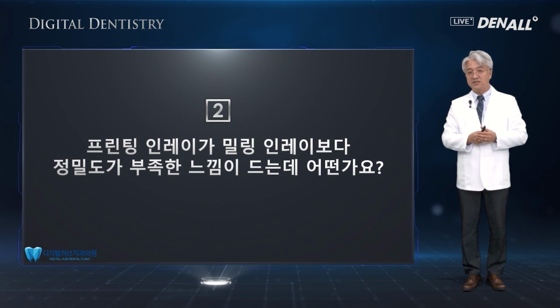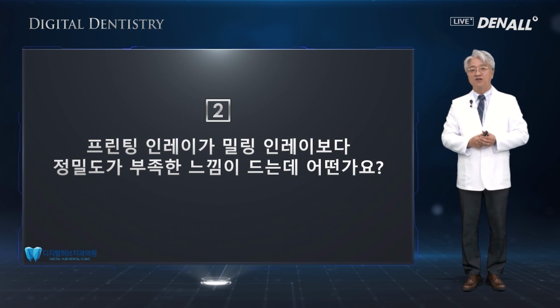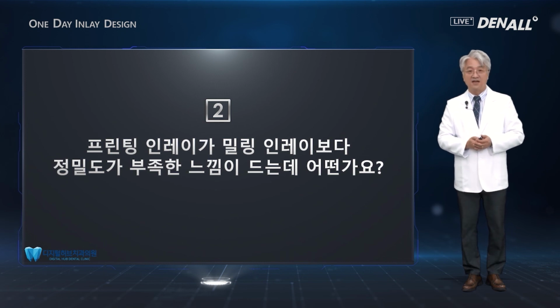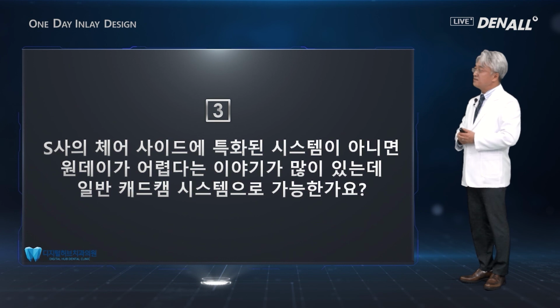And as I showed you with actual cases, as the precision level keeps improving, I believe that very soon it will be as precise as milling inlay, in my opinion.